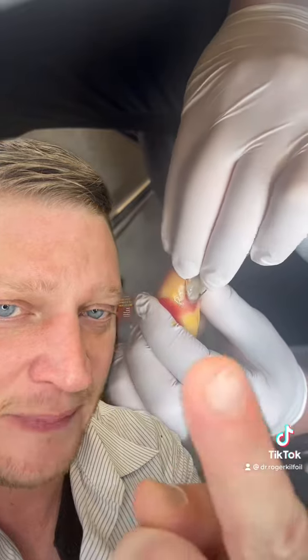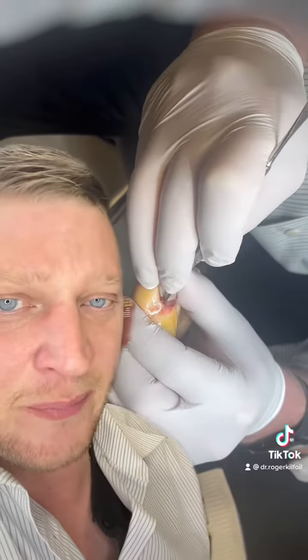You can see this bloody stuff mixed with a little bit of my local is dripping out. I had done a local block — that's probably the most painful part. I'm using my spatula to separate the nail bed from the nail plate. Here you can see how I dive in underneath that thing and you can see all that evacuate coming out.